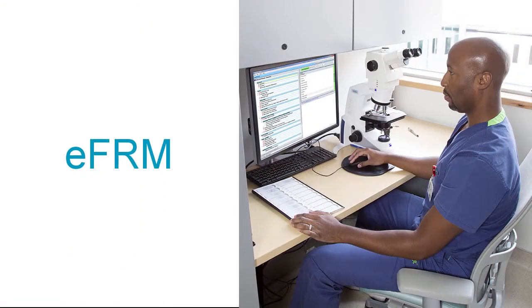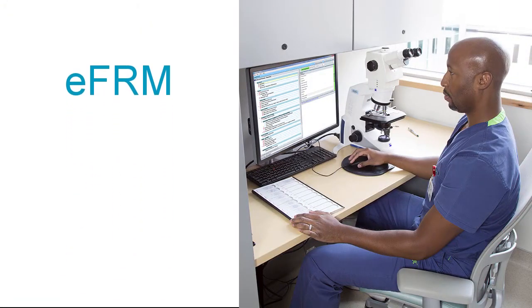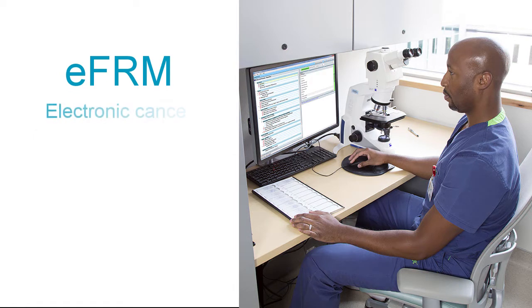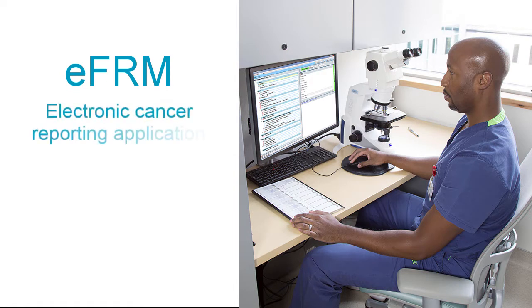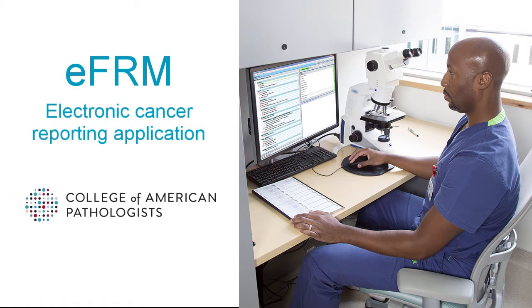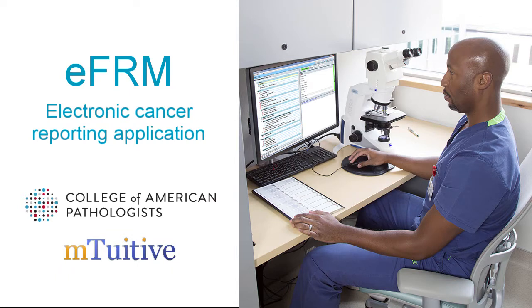E-Form is a complete, easy-to-use electronic cancer reporting application for pathologists. The College of American Pathologists, in partnership with M-Tuitiv, a leader in developing software for synoptic reporting, created E-Form.